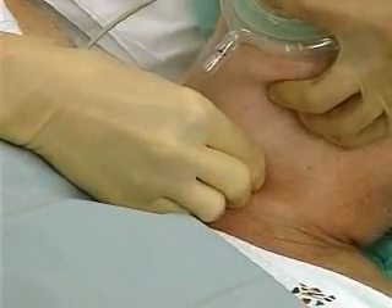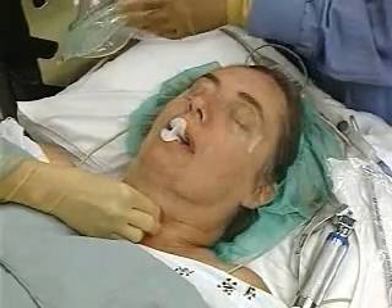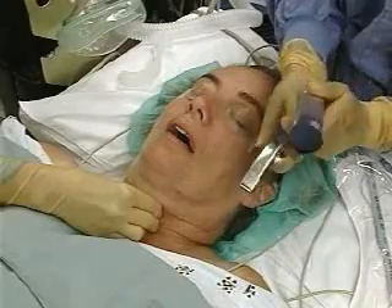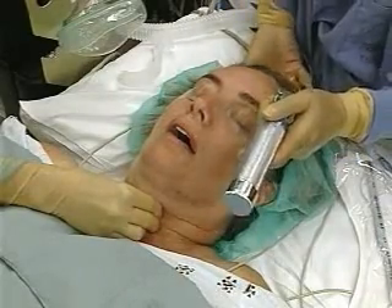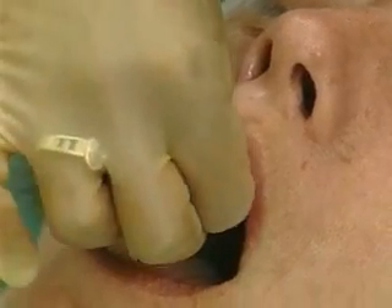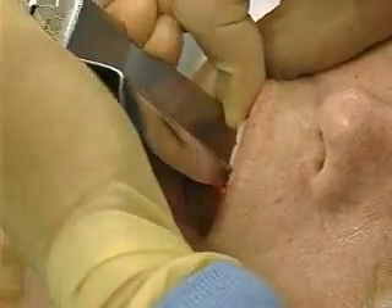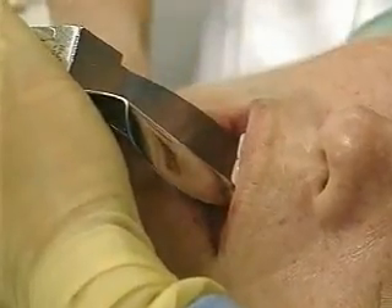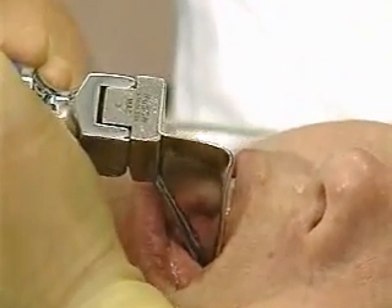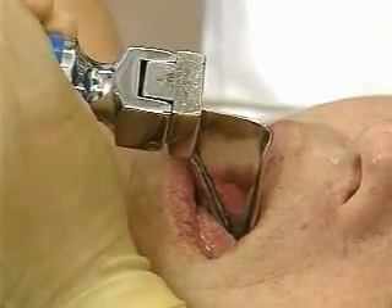Have an assistant apply cricoid pressure using the Sellick maneuver. Remove the oral airway and grasp the laryngoscope in the left hand. Instruct the awake patient to open the mouth as widely as possible. In the unconscious patient, place the thumb and second fingers of the right hand on the right upper and lower molars and open the mouth with a scissor-like motion. Gently place the laryngoscope blade in the right side of the mouth, taking care to avoid damaging the teeth. Sweep the tongue to one side while advancing the blade toward the glottis, positioning the end of the blade under the epiglottis or in the vallecula depending on the type of blade used.